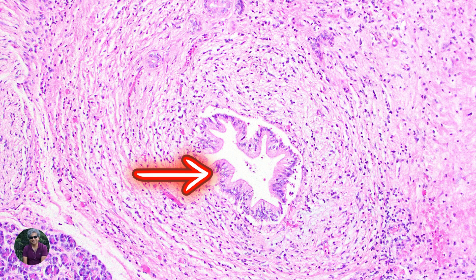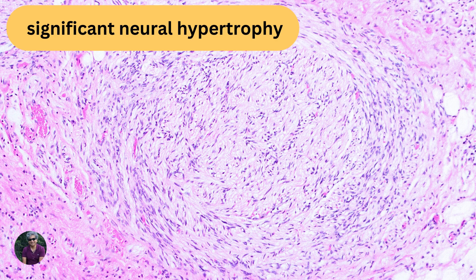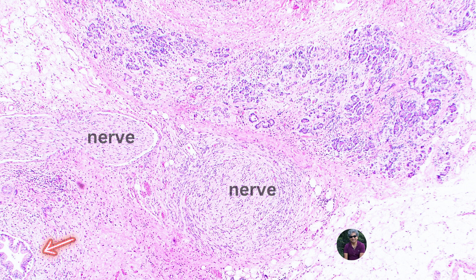Here's another focus — a benign-looking gland with a nerve around it. This does look very much like perineural invasion, doesn't it? There's the offending gland, there's the nerve around it. But notice there are many other nerve twigs around that focus — there is very significant neural hypertrophy here. These hypertrophic nerves were distributed throughout the pancreas. My hypothesis is that the sheer volume of neural proliferation causes that gland to get stuck within that neural proliferation, mimicking perineural invasion.